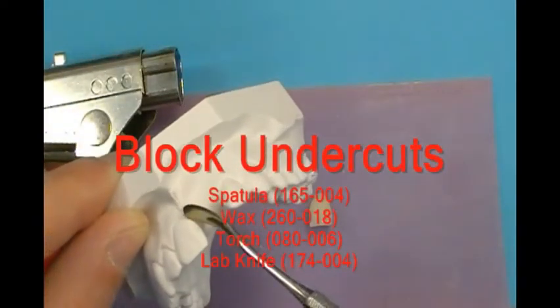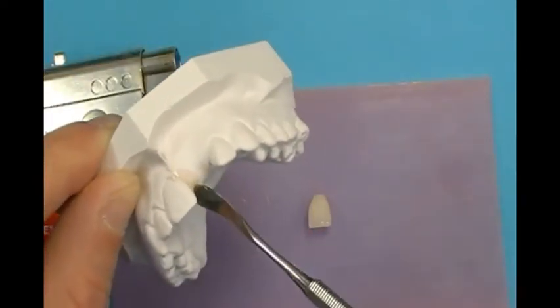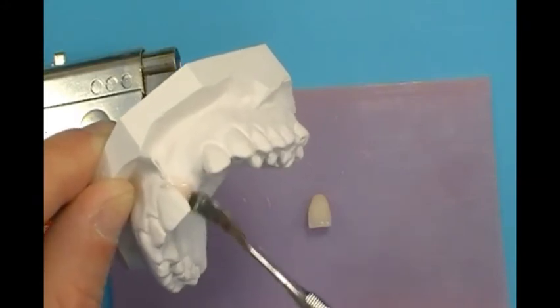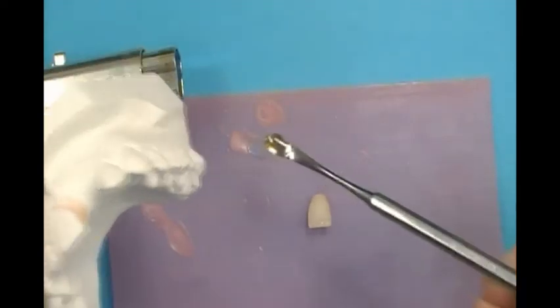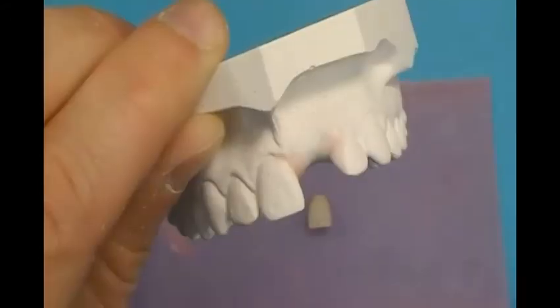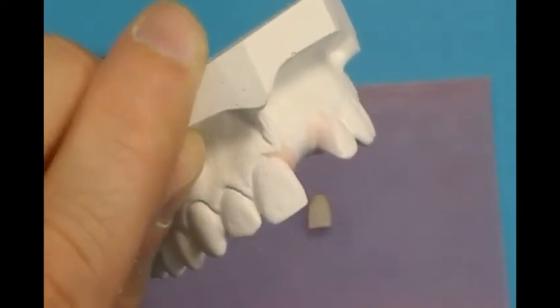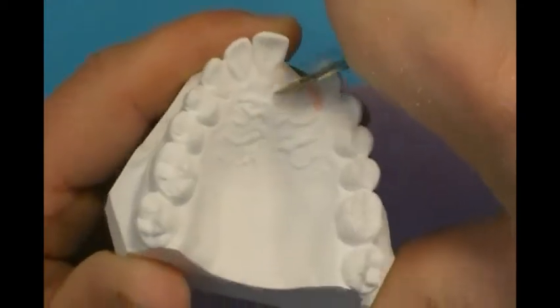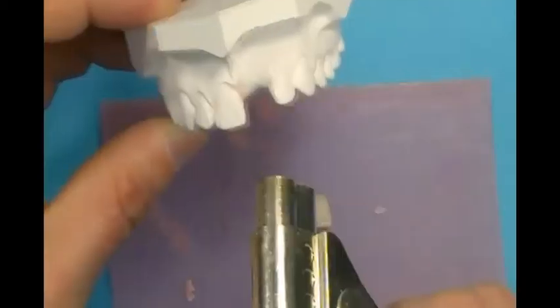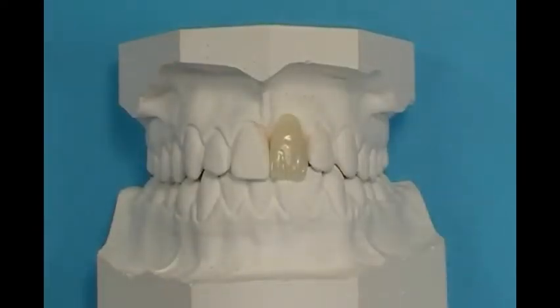With medium soft hygienic base plate wax, relieve interdental undercuts along the cervical crowns of adjacent teeth to the pontic. Also apply a small layer of wax to the facial or labial tooth surfaces. Remove excess wax with a lab knife. Wax should remain at undercut areas; smooth with a torch. Place the pontic on the model to confirm fit after undercuts are removed, and adjust the pontic if needed.